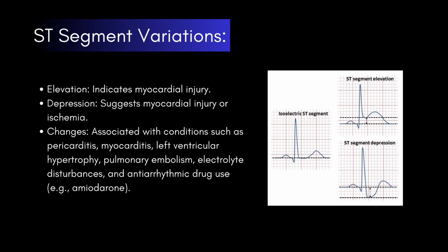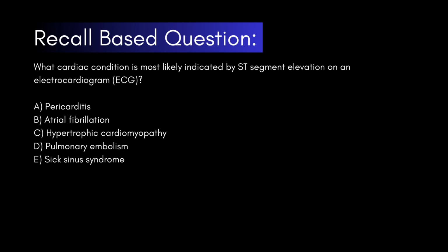Let's go ahead and test our knowledge with some questions. What cardiac condition is most likely indicated by ST segment elevation on an electrocardiogram?